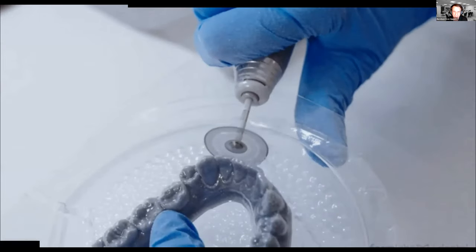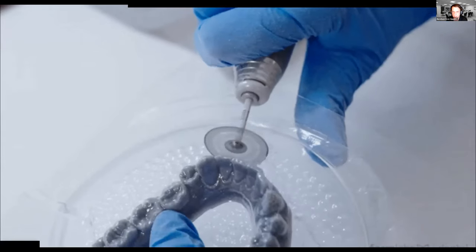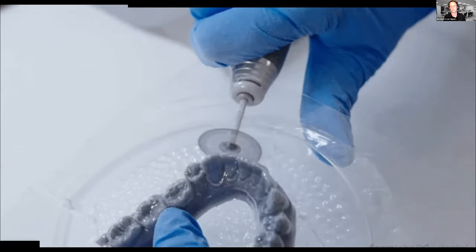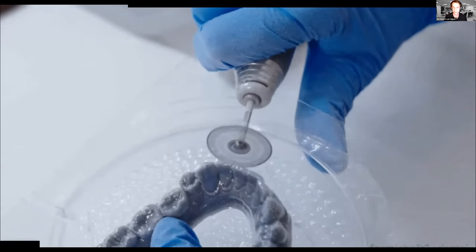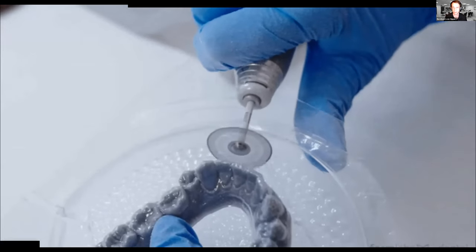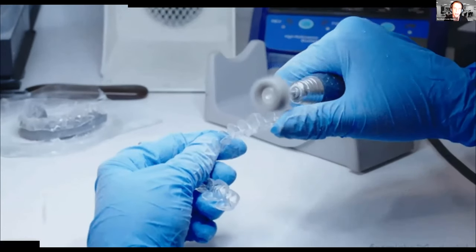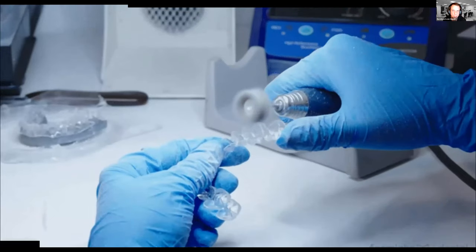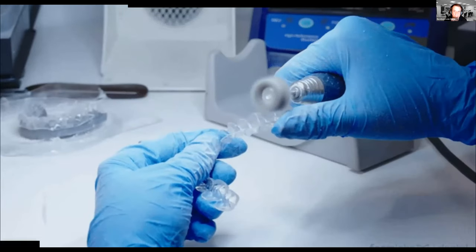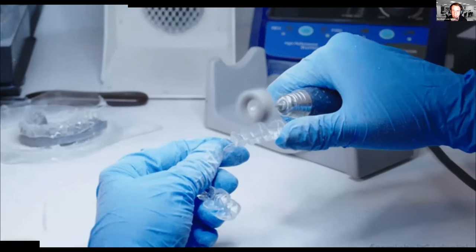And here again, I would use the scissors instead of the cutting disc, because the cutting disc, as I said, is heating up the material. And as it is a thermoplast, your disc can get stuck in the thermo sheet, or you can even deform parts of the aligner. So then the final contour is usually shaped using a carbide cutter. They allow you to go into the interproximal areas a lot, and give the edge of the aligner a nice and smooth curve.